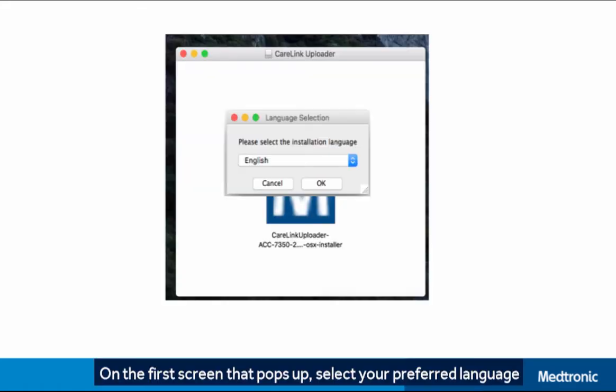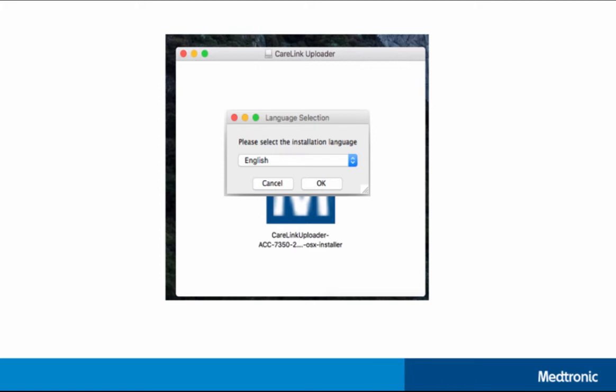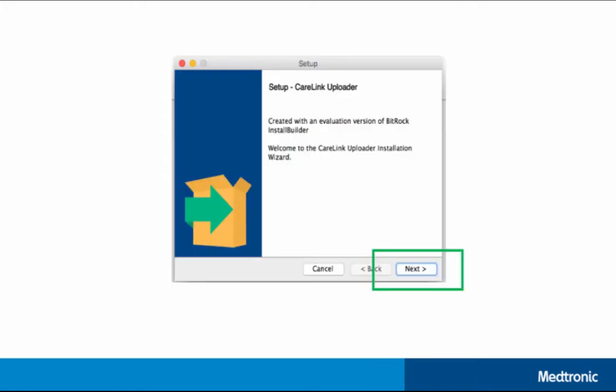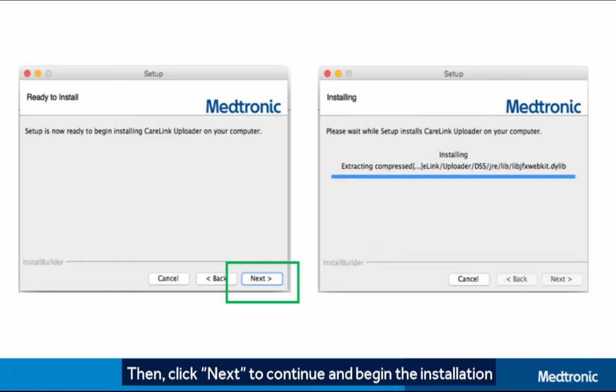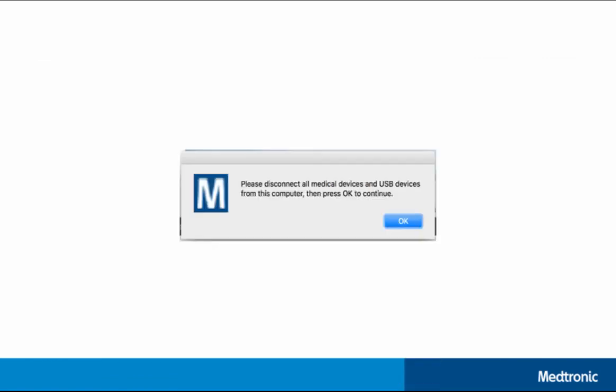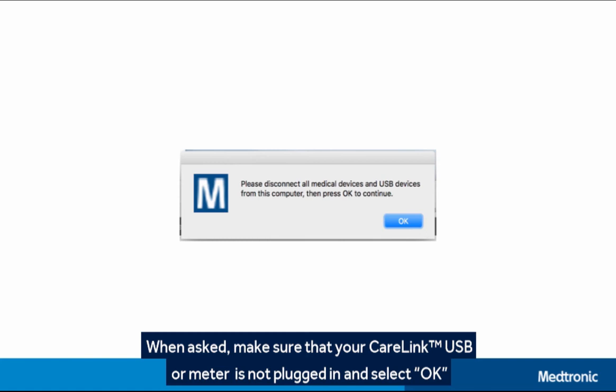On the first screen that pops up, select your preferred language. Click Next to begin installation, then click Next again to continue. When asked, make sure that your CareLink USB or meter is not plugged in and select OK.